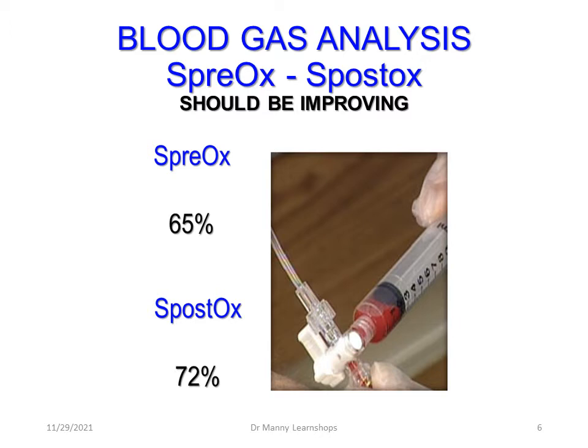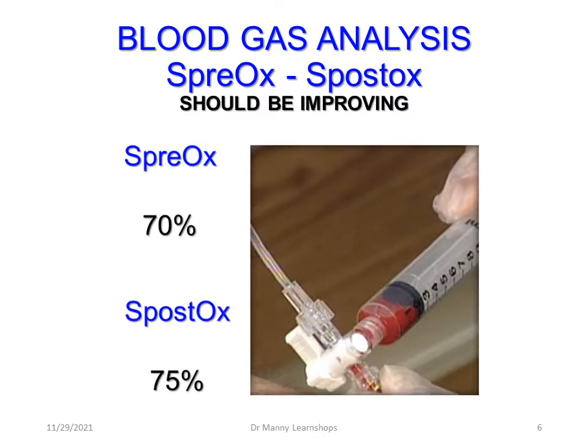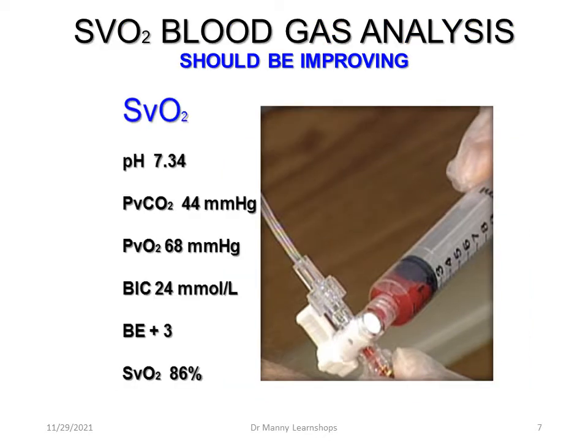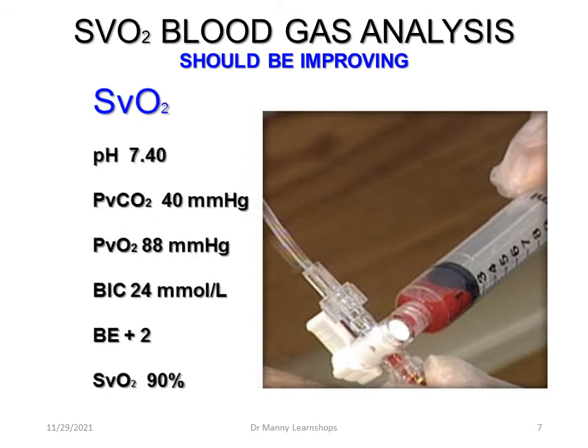When it comes to blood gas analysis, if we're looking at the oxygenator, pre-ox should be 65%, post-ox 72%, and improving. Improving, pre-ox 70%, post-ox 75%. Improving, pre-ox 75%, post-ox 98%. When we're looking at venous saturation, blood gas analysis, it should be improving. We're looking at saturations here, SVO2 86%, 89%, 90%. The blood gas is essentially normal.